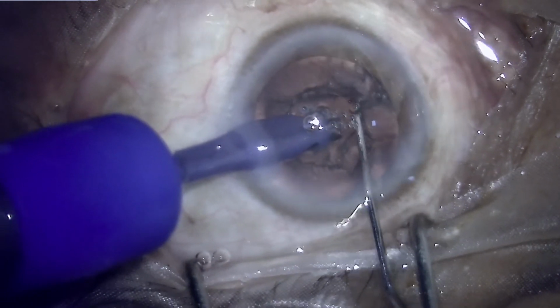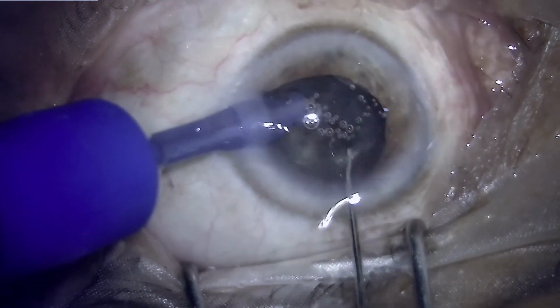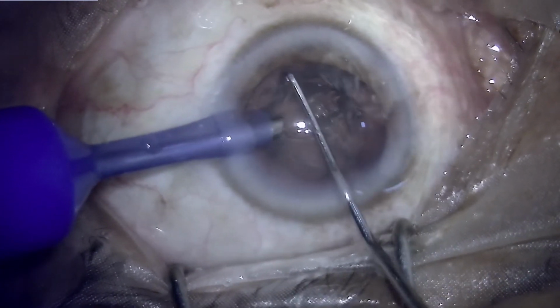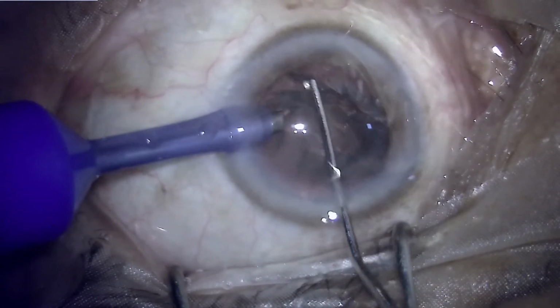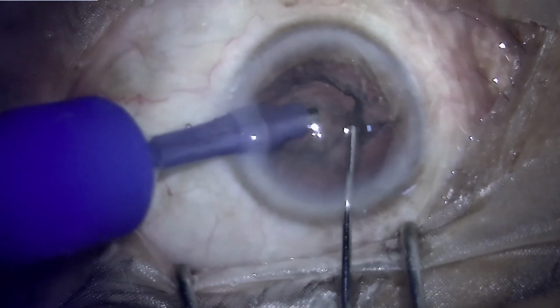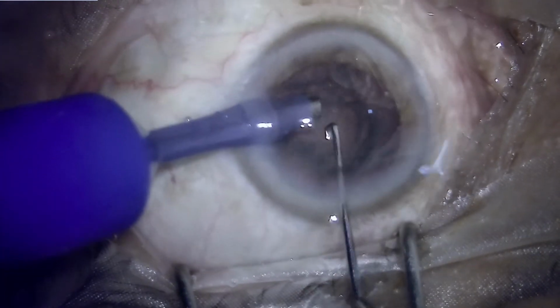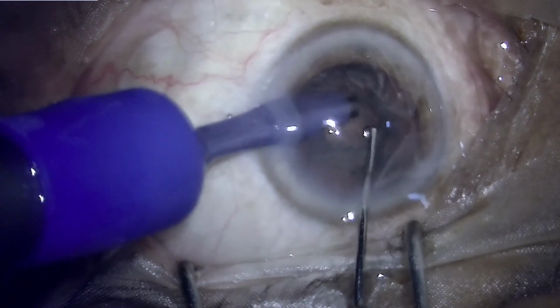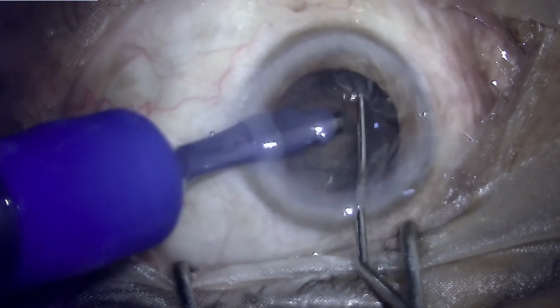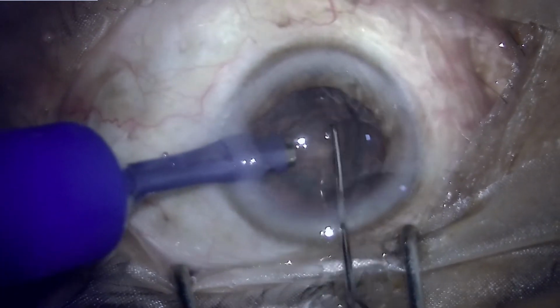So I will see that the unique problems are that first of all there is very soft nuclei, so it's difficult to bury confidently into the tissue because there is a constant fear of going through and through into the nucleus, which may cause a PC tear with a nuclei in the bag. Second problem is that whenever you try to catch hold of nucleus by burying the tip, the pieces of the nucleus simply bite off from the main nuclei, and there is no holding power whatsoever left for the phaco tip to hold on to.